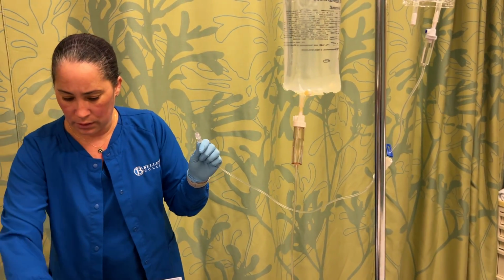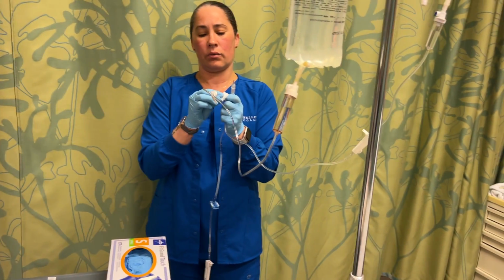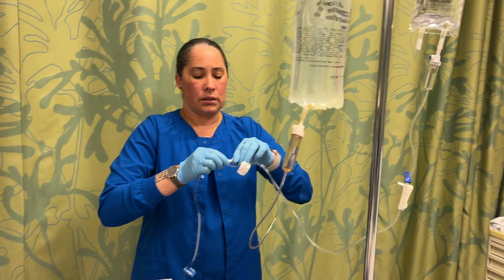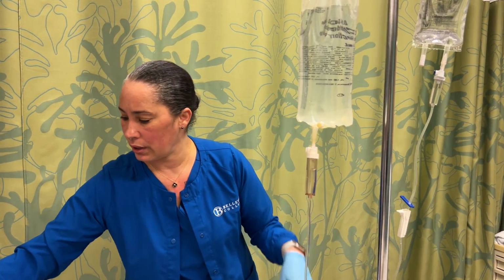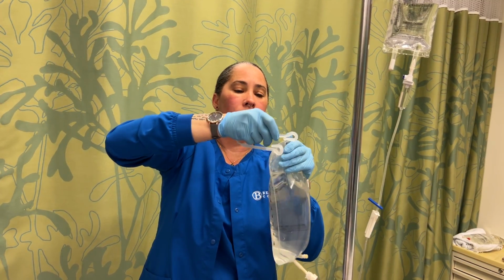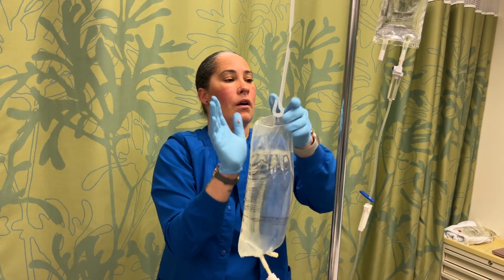All right, so alcohol. We're going to clean the port here. This is our Y port. And you're going to rub this same 15 seconds, let it dry for 5. And you are going to attach this here. Same screw system, just make sure it's screwed on all the way. Okay, and then here's the trick. We are going to lower this bag because that will prevent the fluid from going into that bag and allow that to flow, and this will turn off.